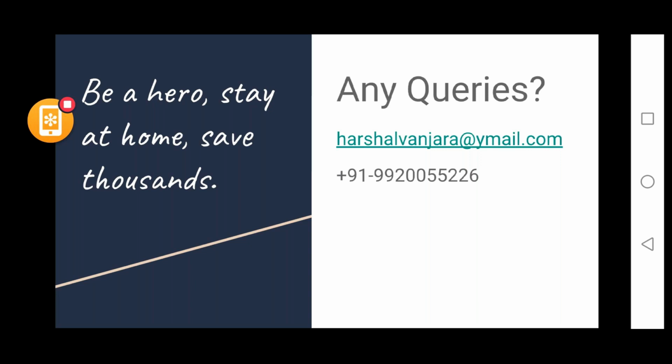If you're using the true aberrometry machine, and you find that there are changes between the subjective acceptance and the refraction you find in the aberrometry machine, yes, you need to do a cycloplegic refraction. If you see differences between the two, it means the accommodation of the patient is active, and you might get falsely high myopic readings or a falsely high myopic refraction.